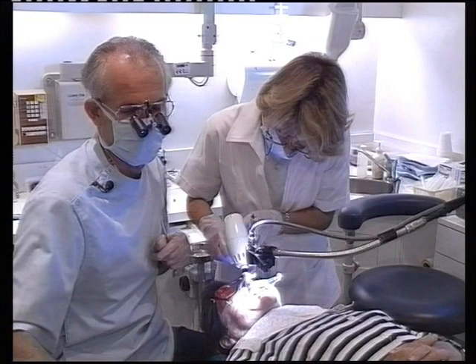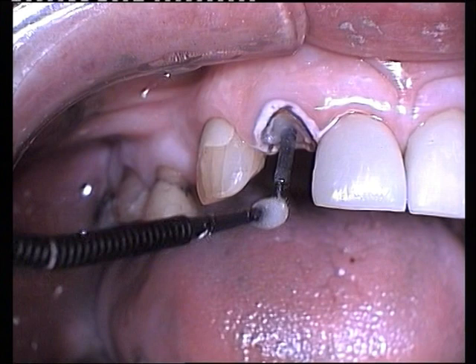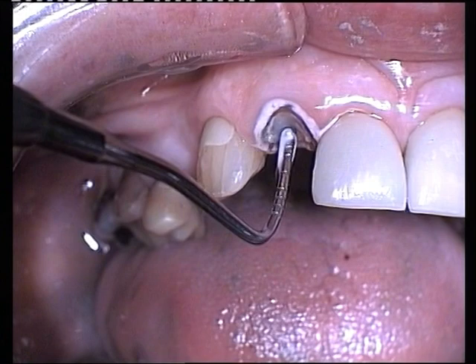A layer of Fuji Bond LC is placed over the post and an increment of white tint is coated over the labial surface to block out the black post. The preparation is spot-cured for 5 seconds.